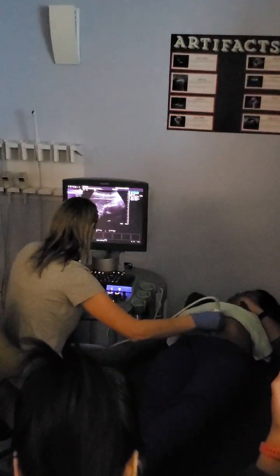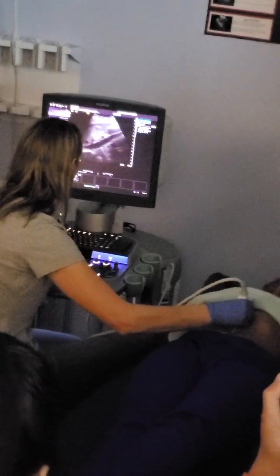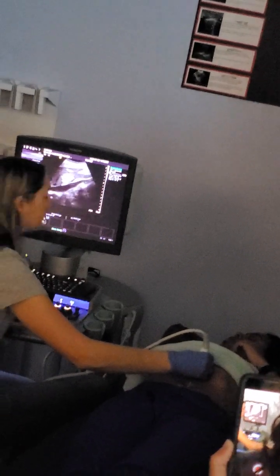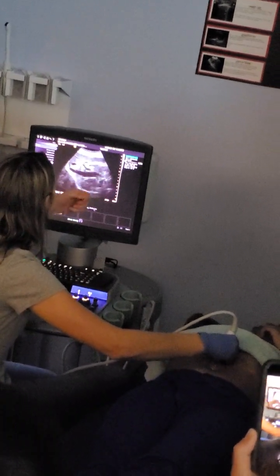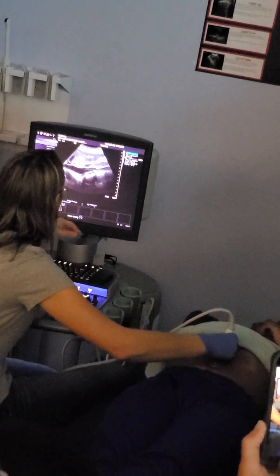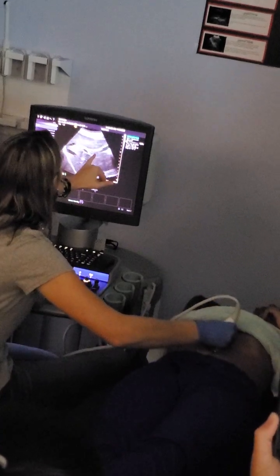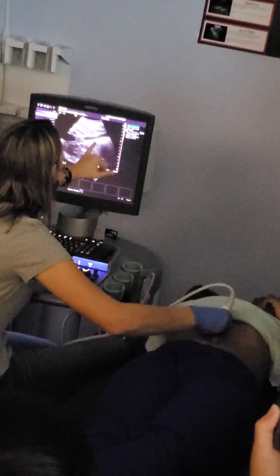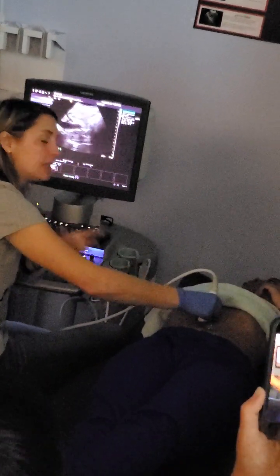All right, so finding our gallbladder. Let me get some depth, just so you guys have a little idea. Okay, put a big breath in. So we know this main portal vein crossing the IVC. We just saw him this way crossing the IVC. And so we're in sagittal. We're just going to keep following him, and eventually it's going to lead us to the main lobar fissure where our gallbladder is. Now the gallbladder, when you breathe, it can live in here anyway.